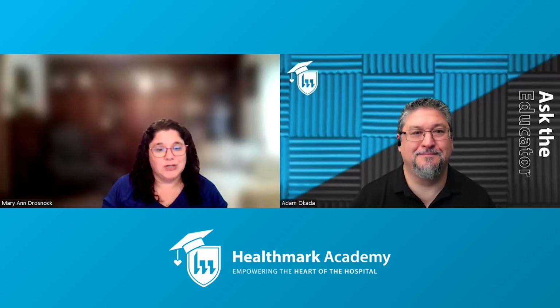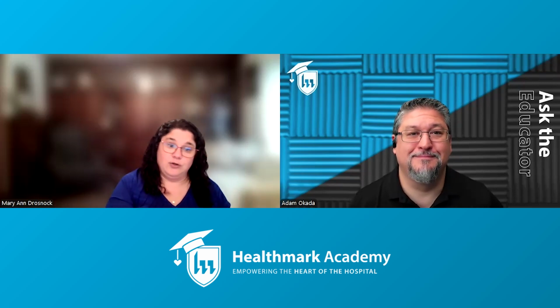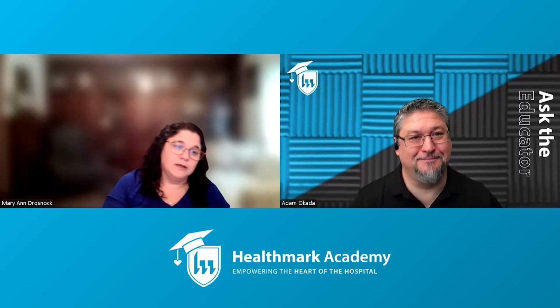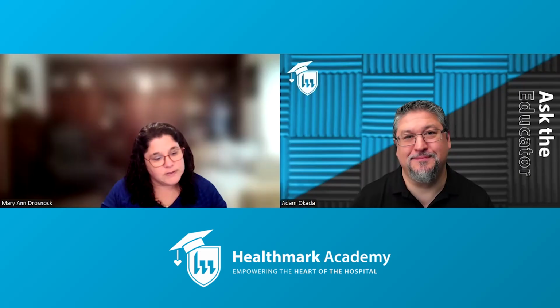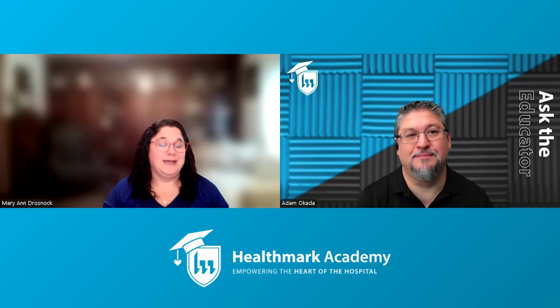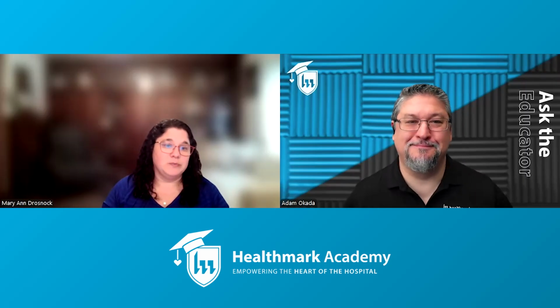But that's a challenge, Adam, because how are you going to make sure you prioritize now? You're prioritizing these scopes through the process over everything else? Then what, your other scopes sit? It's a really bad position, I think, for facilities to be in, to try to figure out what to do with this. And then we're not really getting good guidance on what to do if you do have a delay in reprocessing, because inevitably that's going to happen in places where something gets missed and that duodenoscope sat there for longer than an hour.